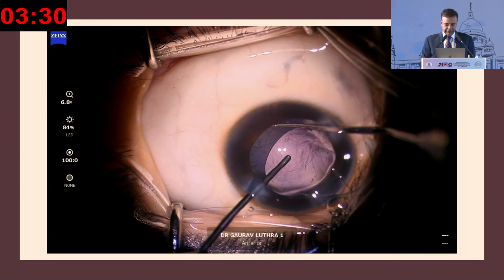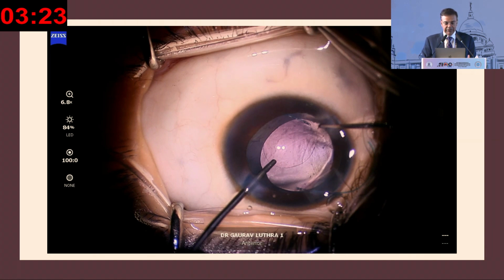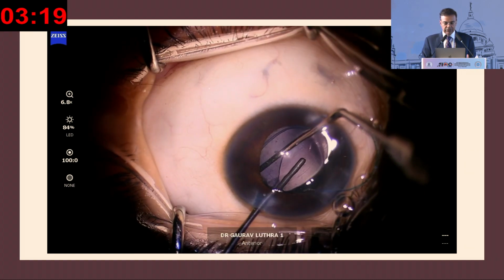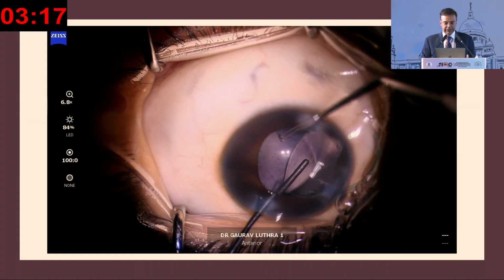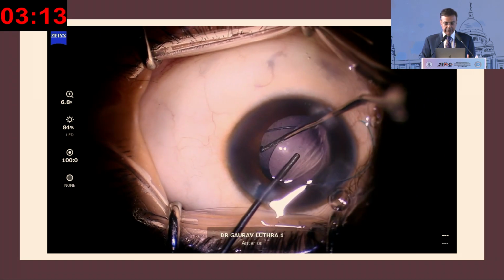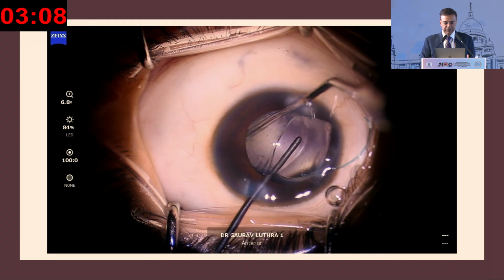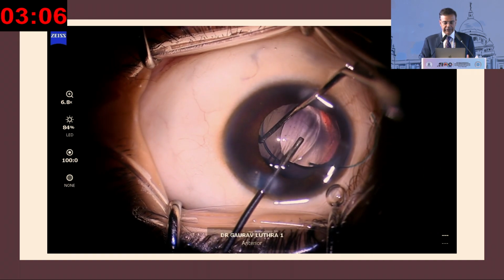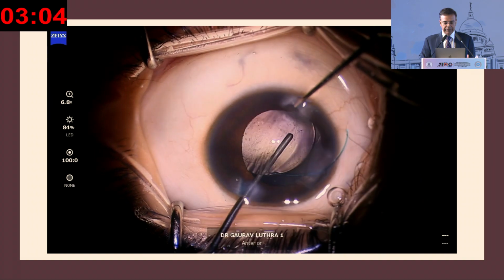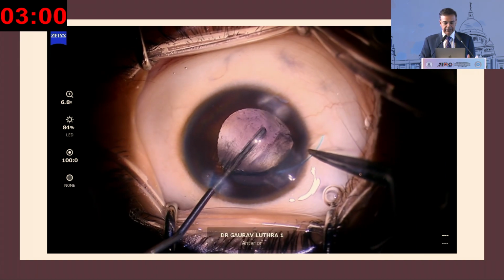So first thing that went wrong was that my haptic, which had gone into the sulcus and I wanted to place it in the bag, I was having trouble retrieving it because it probably went to the edge and went through the zonules at some point. So when I tried to retrieve it, the bag was coming along with it. So there I should have switched to a forceps long before. The easy thing is to just go there and hold it with a forceps. A Glued IOL forceps would be just right, and just bring it, retrieve it. Here I'm able to finally do it, negotiate it into the bag, and then negotiate the optic into the bag.